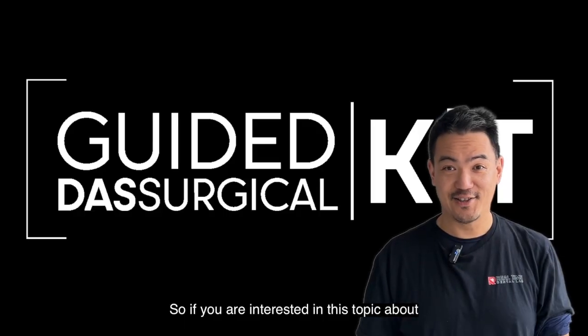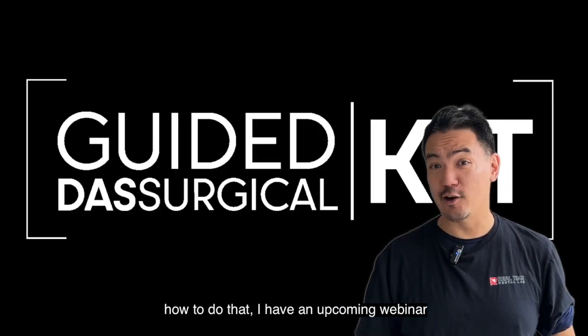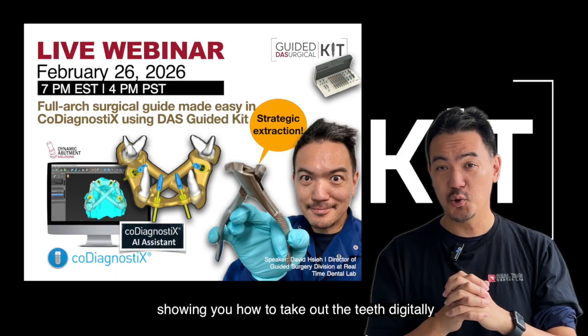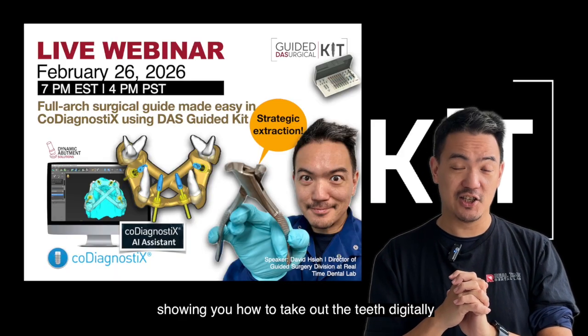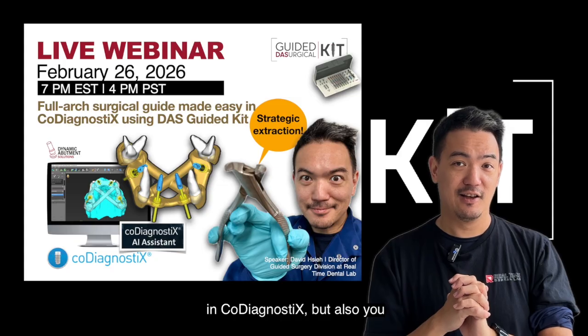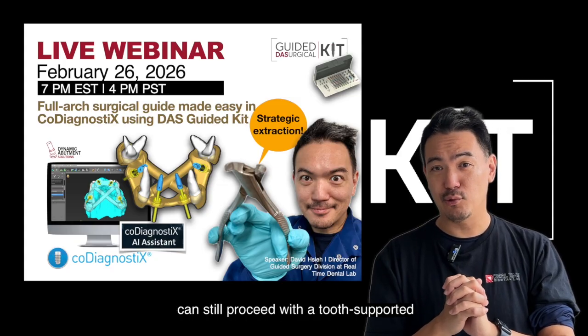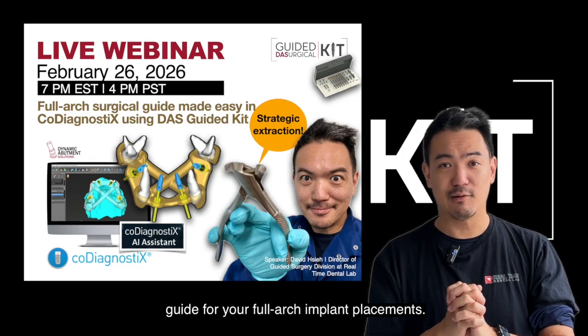If you're interested in this topic, I have an upcoming webinar showing you how to take out the teeth digitally in CoDiagnostiX, but also how you can still proceed with a tooth-supported guide for your full arch implant placements.